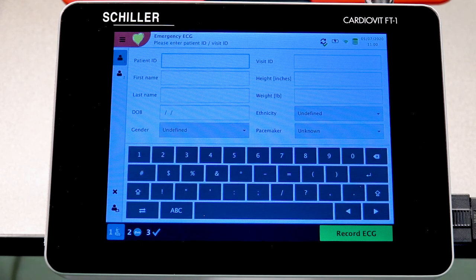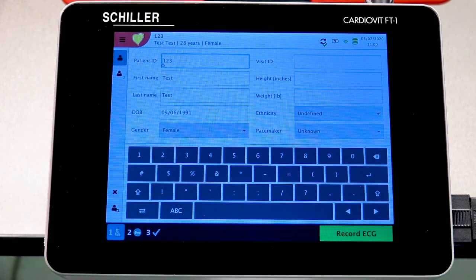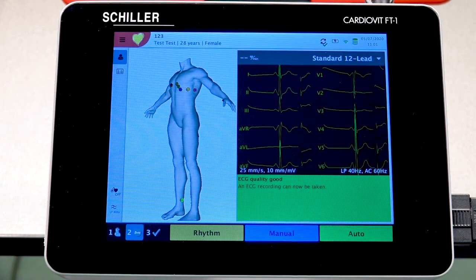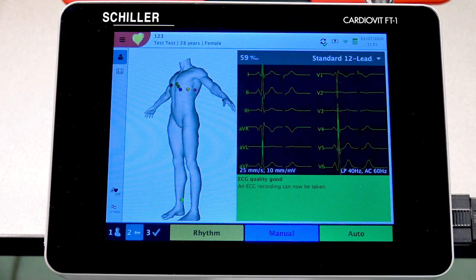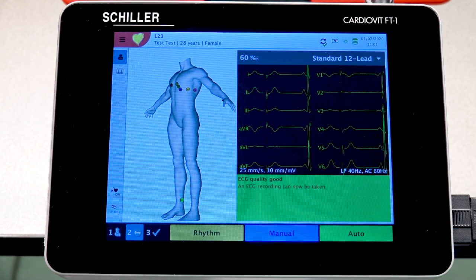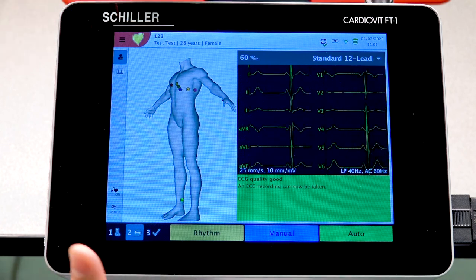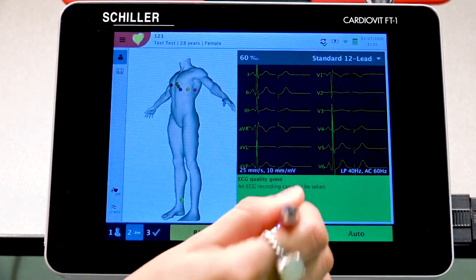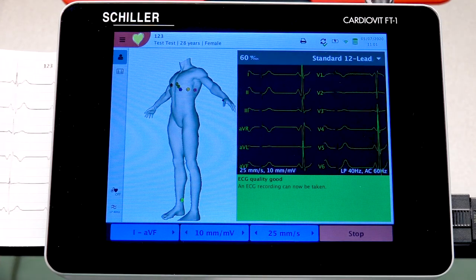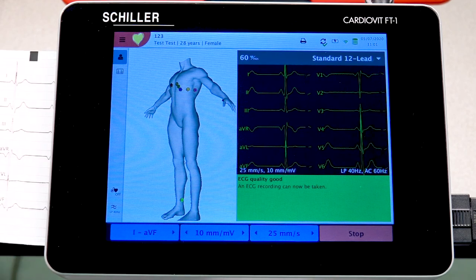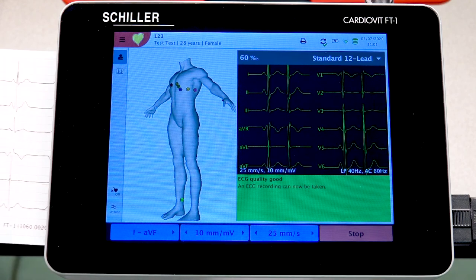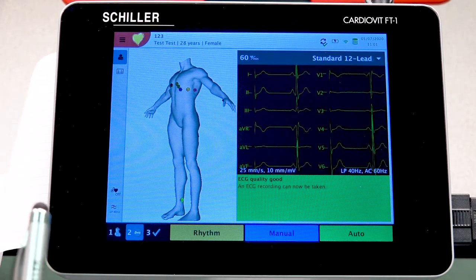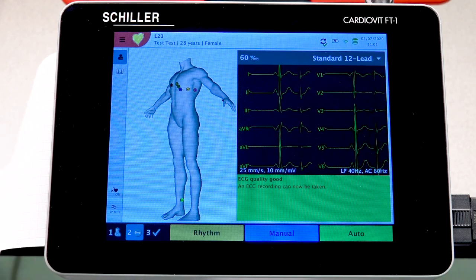Once again, we'll use the previous patient recall and move forward with Record ECG. We've already demonstrated auto and rhythm, so now we'll show manual. With manual, the unit automatically starts printing out what it currently sees in real time. To stop the printing, you must select Stop. If you do not press Stop, the unit will continue printing the ECG waveform indefinitely until you manually stop it.